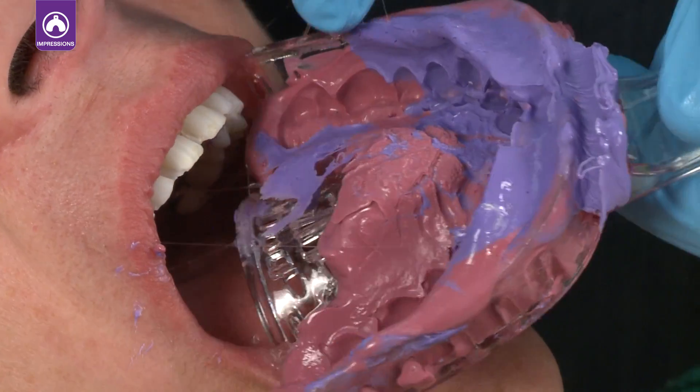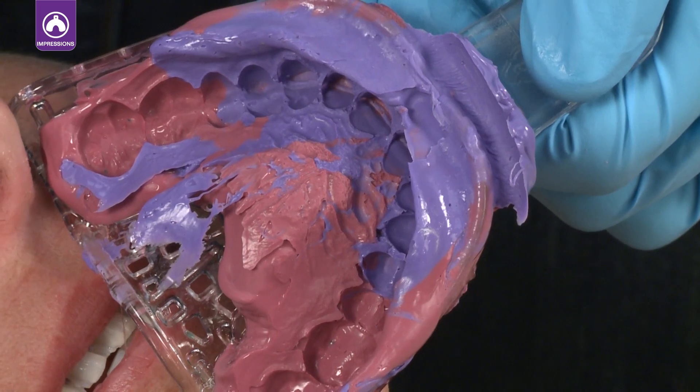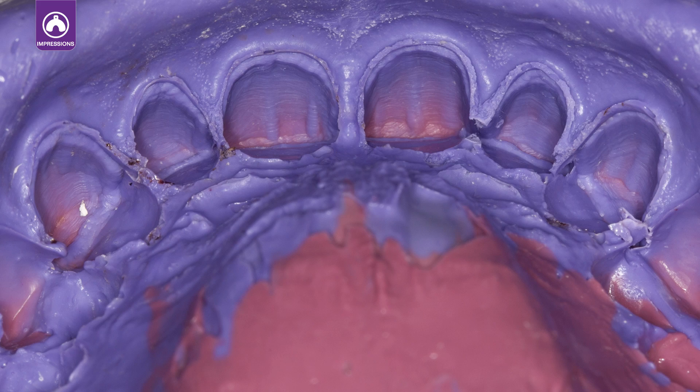After the material has set, remove the tray. Check the margins and preparation for air or saliva bubbles. After the final impression is inspected, remove the second retraction cord.